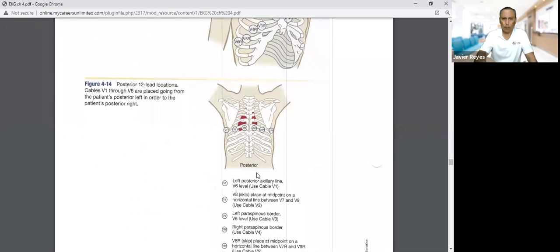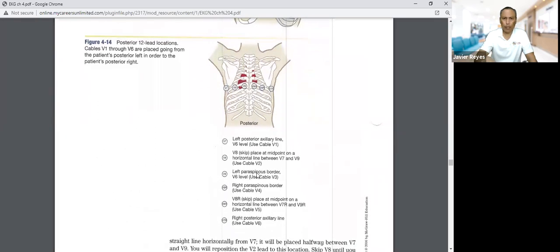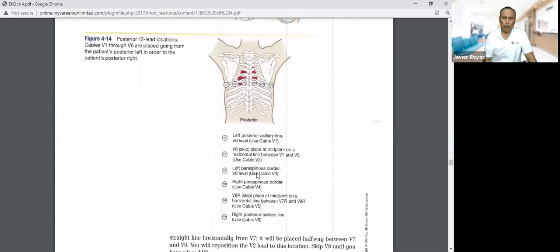And so on. So again, these are rare. You don't really perform these very often, but they can be done. Say, for example, the person, I don't know, for some reason they have surgery on their chest. They can also order a posterior EKG, and you would follow this setup right here on figure 4.14.